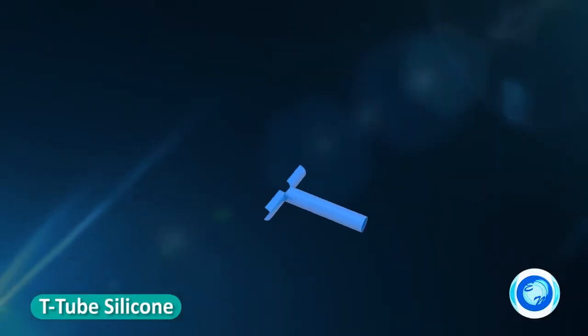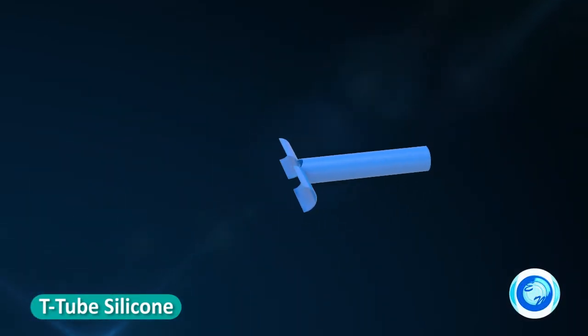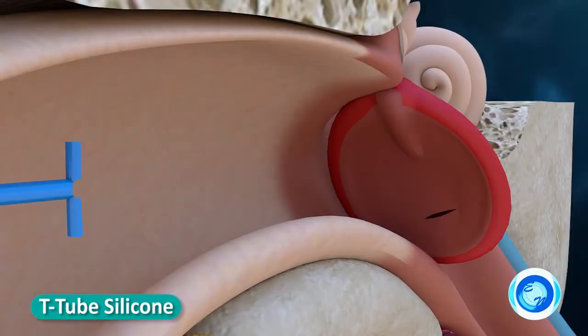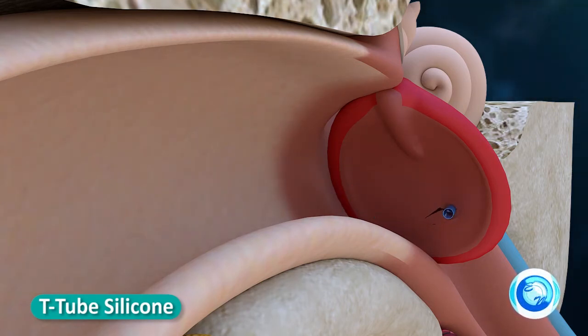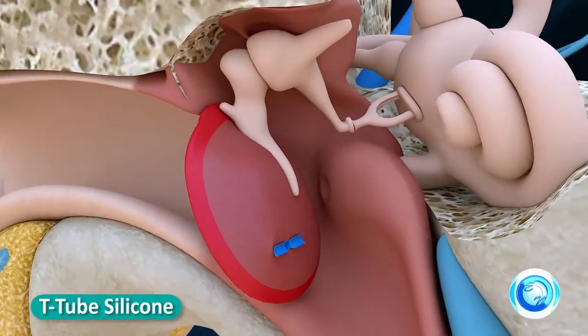T-tube: silicone material that can be compressed for easy insertion. The inner flange length is 8 mm, which is larger than other tubes, so it stays in place for a very long time. Total length variations are available in 6, 9, and 12 mm, which may help resist water, ensure stable positioning in the tympanic membrane, and allow easy removal.